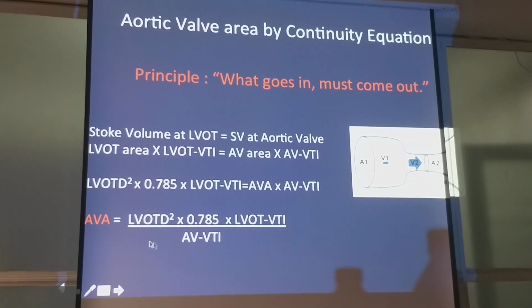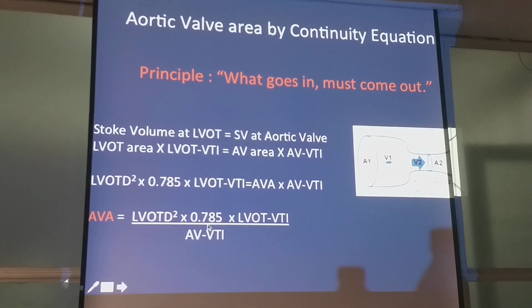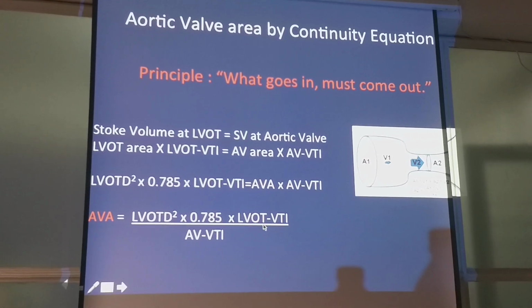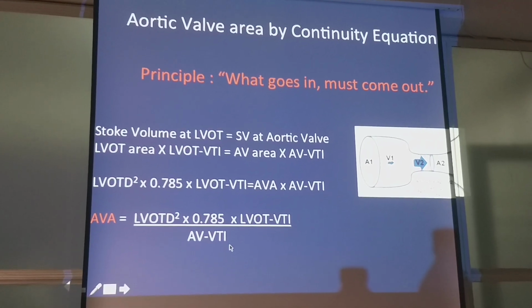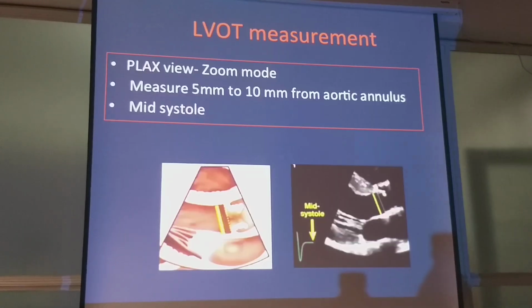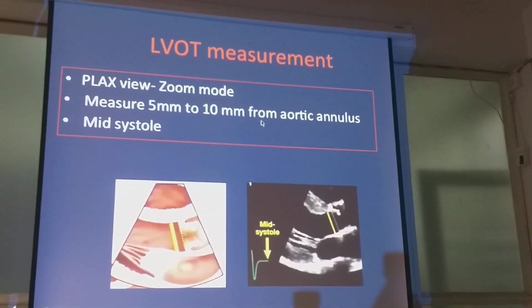তাহলে আমাদের এখানে কি কি মেজার করতে হয় দেখো, ডায়ামিটার মেজার করতে হবে, LVOT VTI মেজার করতে হবে, and aortic valve VTI measure. Not a big deal. We can measure the diameter. How do we measure the LVOT diameter?